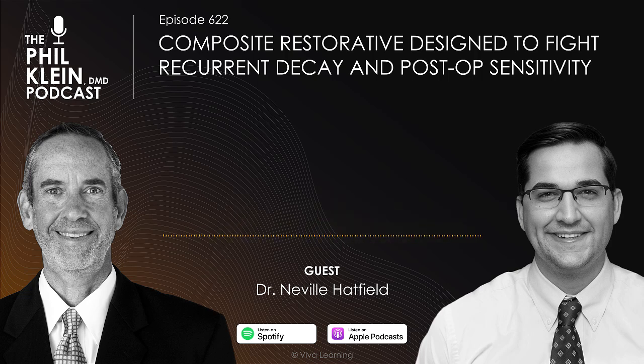But what these materials now can do is they can specifically lower the bacterial biofilm on the tooth and not allow as much adhesion in the first place, which then ultimately stops the recurrent decay, or can help stop the recurrent decay.